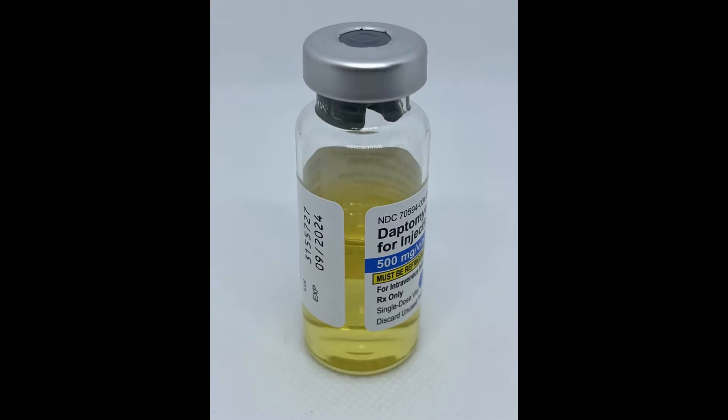Daptomycin comes as a yellow lyophilized powder in 500 mg vials. To prepare daptomycin for IV infusions, the powder must first be reconstituted with 10 mL of normal saline.